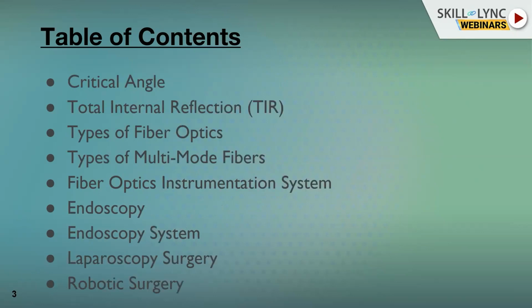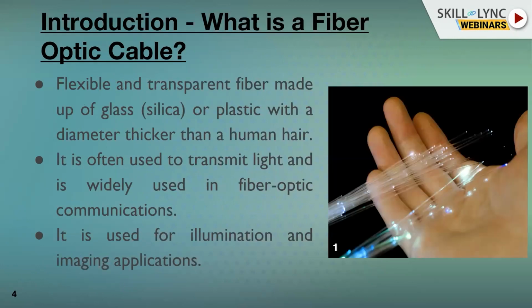Then we will also see different types of fiber optics and how the fiber optics instrumentation system works, and then we'll see how it is used in medical-related areas such as endoscopy, laparoscopy, and robotic surgery. Okay, so let's talk about what is fiber optic cable.